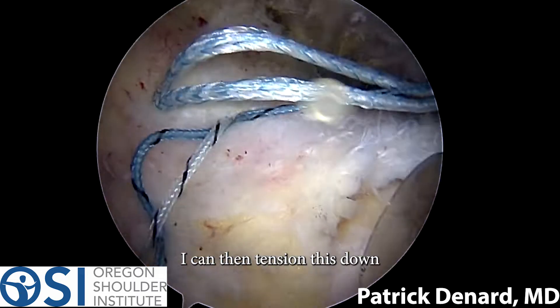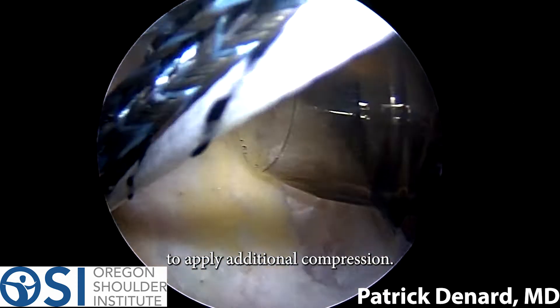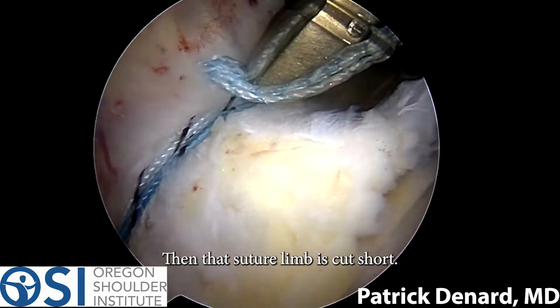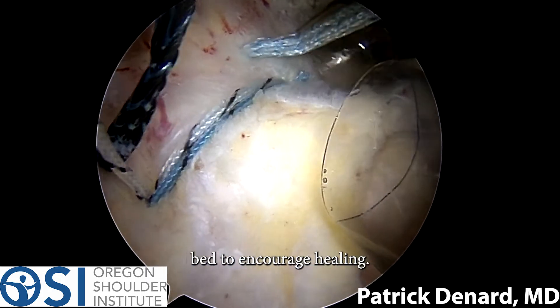I can then tension this down by pulling back and forth and also using a knot cutter to apply additional compression. That suture limb is then cut short. This will really help apply compression of the tendon down to the native bone bed to encourage healing.